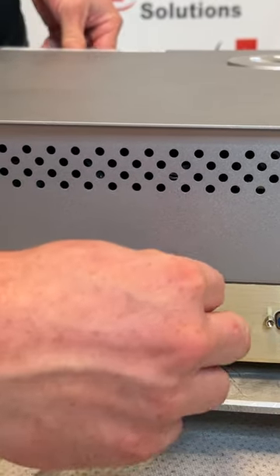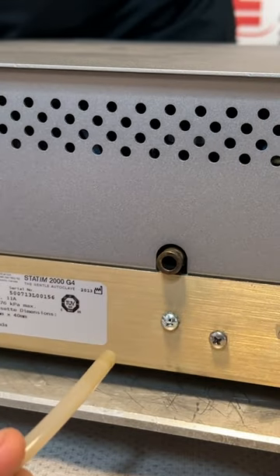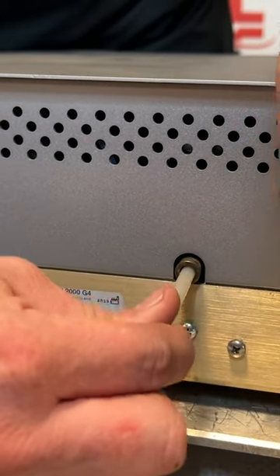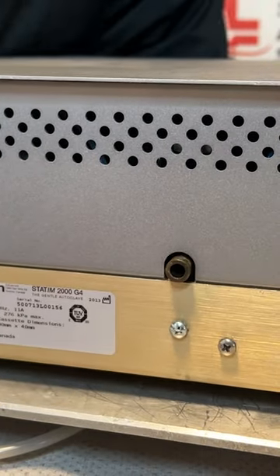To remove the waste tube, you push in on the tube, hold that slip ring in place, and that tube will pull out. It's really simple. If you cannot just pull it straight out, push in on the tube, hold the ring, and it will slide out.